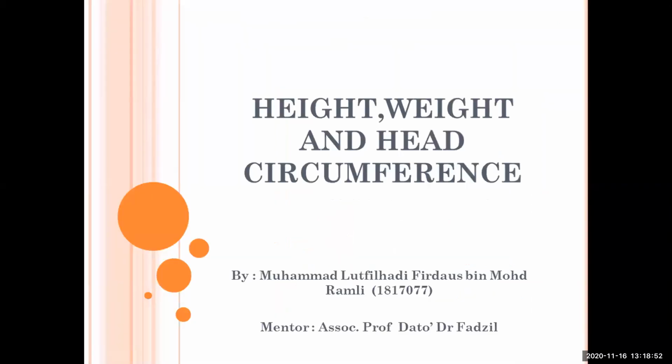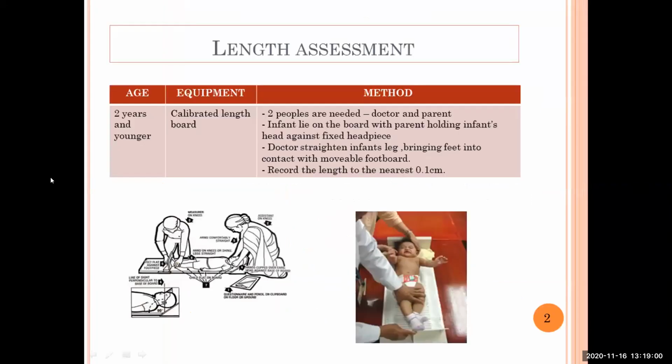Okay, Assalamualaikum warahmatullahi wabarakatuh. My name is Lutfi and I'm going to present about height, weight and head circumference. For children aged 2 years and younger, we cannot measure height, so we measure length using the calibrated length board.